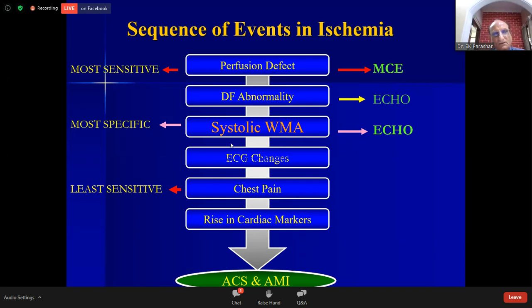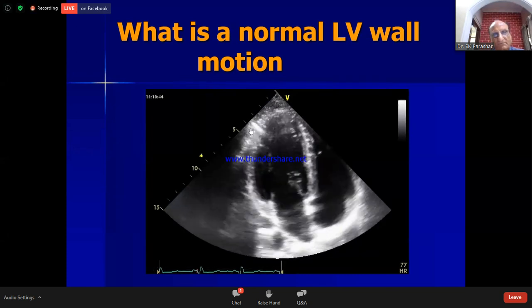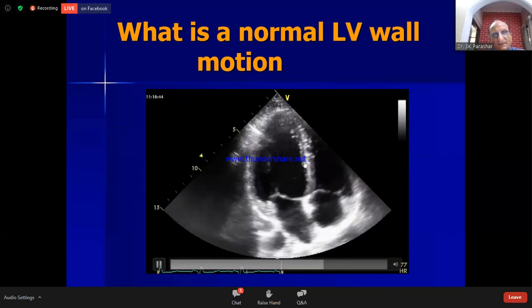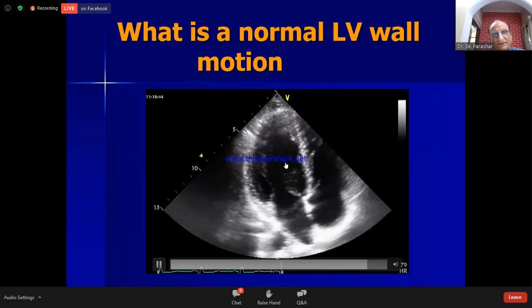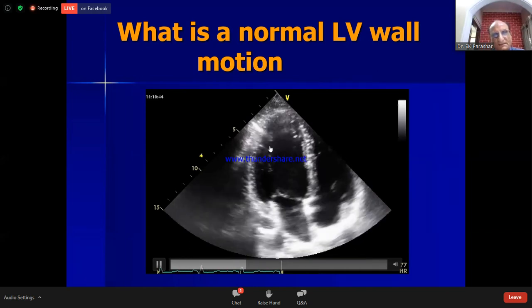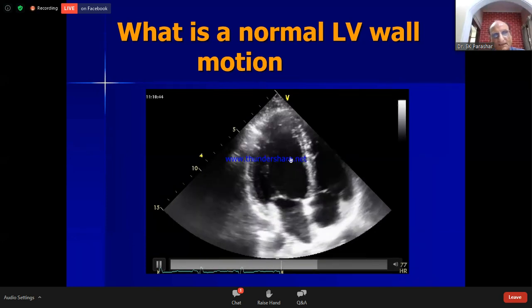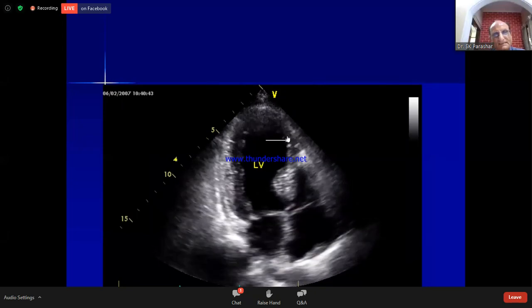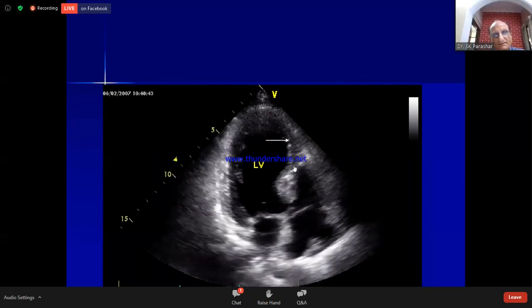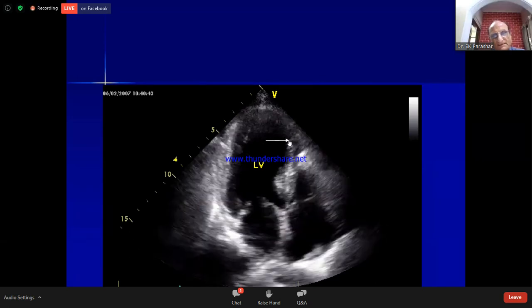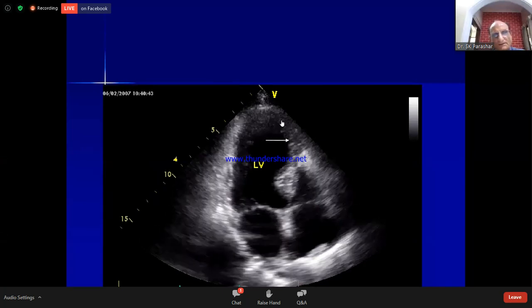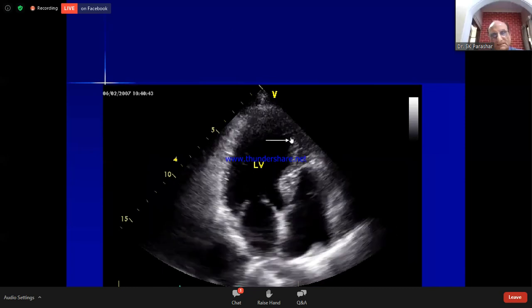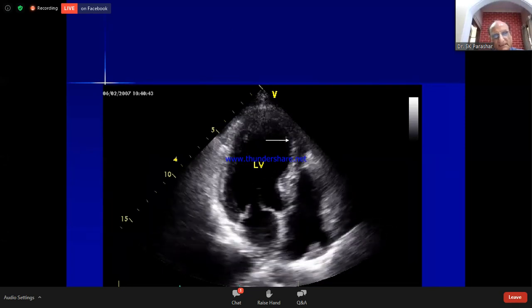The most important finding is systolic wall motion abnormality. In a normal left ventricle, every segment shows systolic thickening — the LV size decreases because in systole all walls come together. In contrast, if there is a complete absence of systolic thickening in the distal part of the septum, that is known as regional wall motion abnormality. One must look for decreased systolic thickening in these segments.